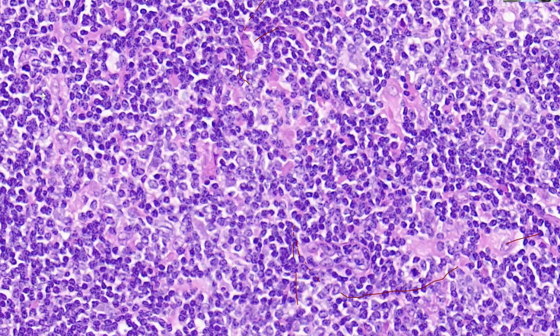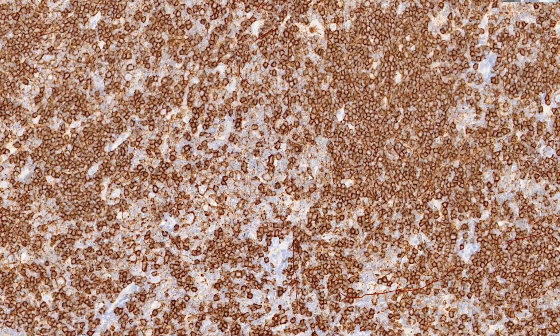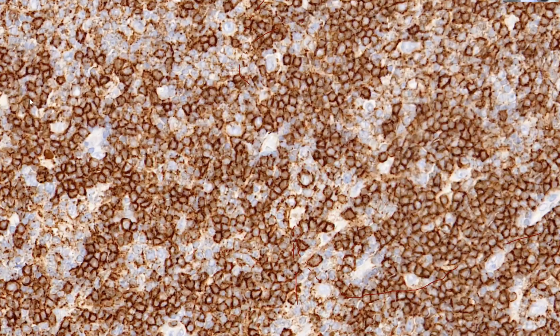I'll just show a couple of immunostains. This is CD20. In these larger nodules, you can see the CD20 staining the larger cells as well as the background cells. Maybe here, that's a good one. So the central cells, the surrounding cells are negative, and you have positive background cells.